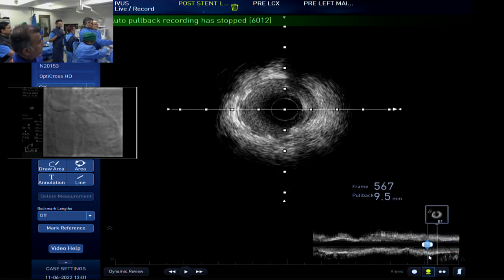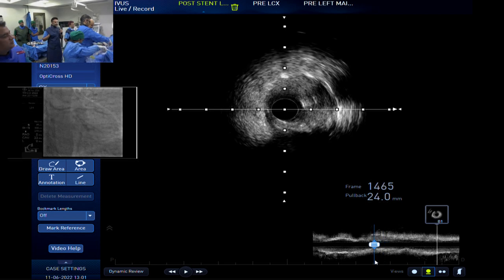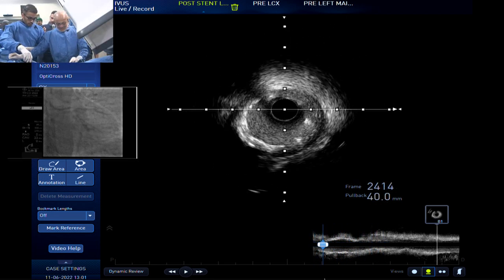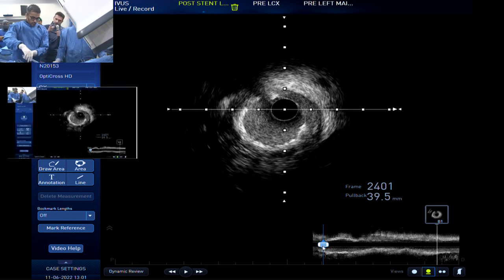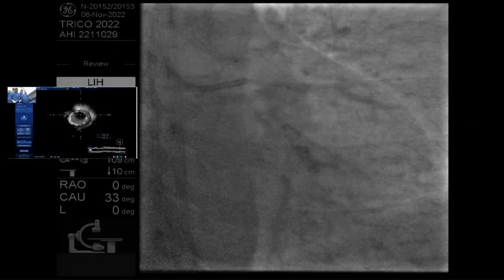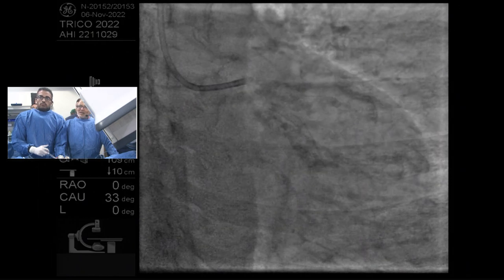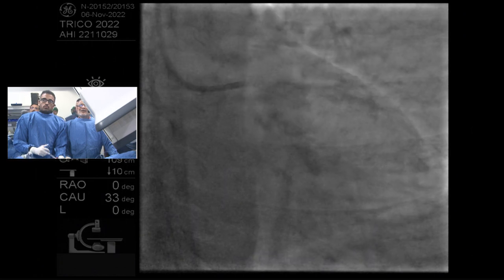Okay, fine. And just before you take the picture, what I generally do is make sure that I fill the guide so that you're not doing the slow injection. You're doing one hard, fast injection, 3 cc's, you'll opacify everything and you're done. But then stay on Cine long to make sure you have no wire. Okay, no problem. Yep, that's the Paul Teirstein method. While I was training at Columbia, Paul was still going back and forth, so I actually learned that from him.